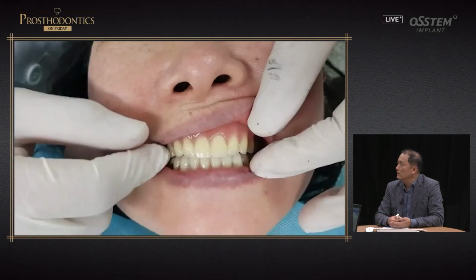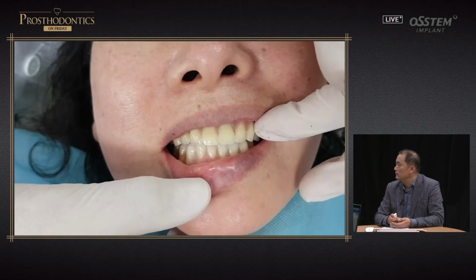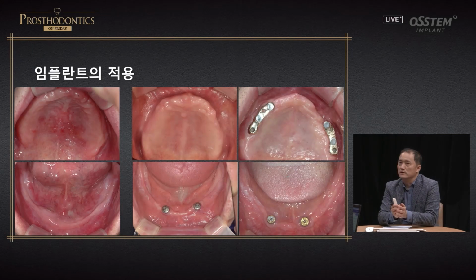But after I have made adjustment, it's no longer shaky. So until you have this type of stability, you have to continuously adjust the occlusion. Next is, actually this is not into the topic, so I'll keep it very short.